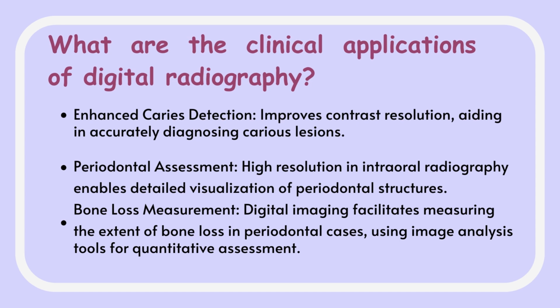Sorry, so the third application of digital radiography in dentistry is bone loss measurement. Digital imaging facilitates measuring the extent of bone loss in periodontal cases using image analysis tools for a quantitative assessment.